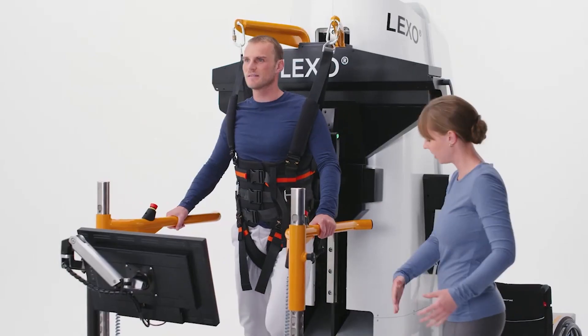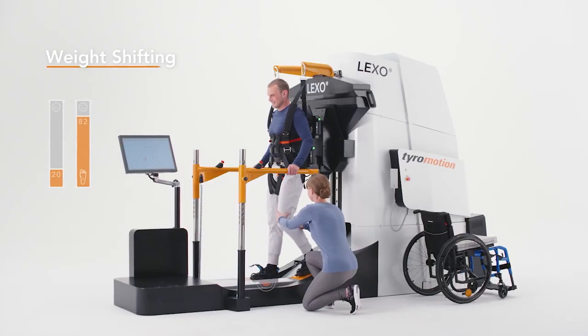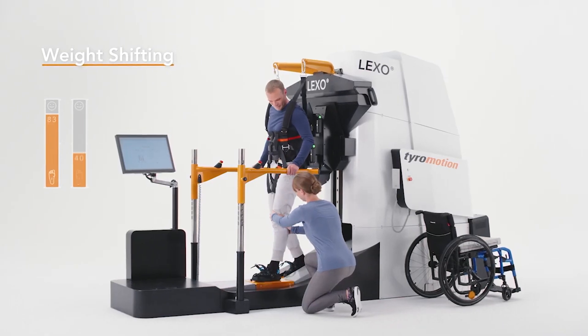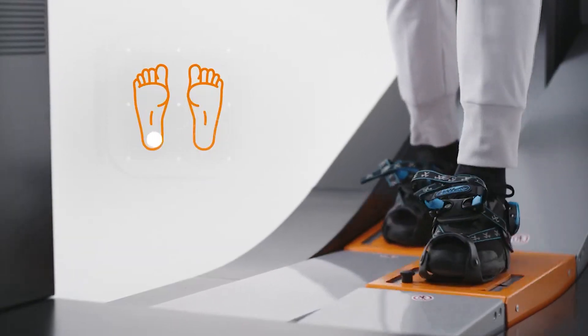Lexo's strength lies in the encouragement of the patient during gait rehabilitation. The task-oriented training requires active weight shifting, load-bearing, and concentration on specific gait elements such as the initial contact. This further promotes the patient's self-activity and the physiological aspects of their recovery.